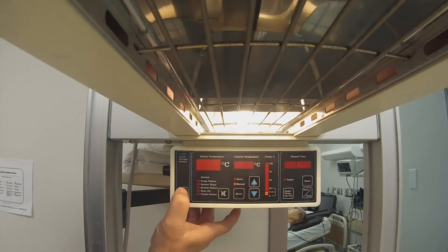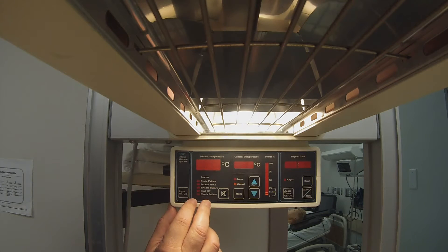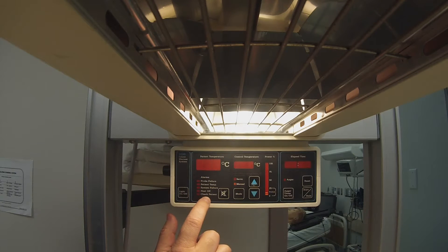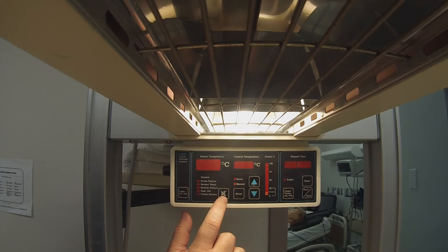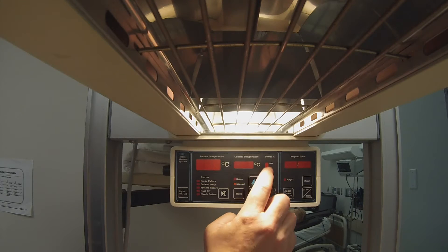Next to that is an illumination for the work center. Below the temperature of the patient, you will find illuminations for alarms and an alarm silence. The alarm silence does not clear the fault — it just turns off the alarm.